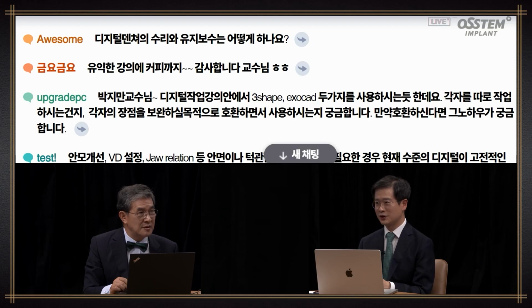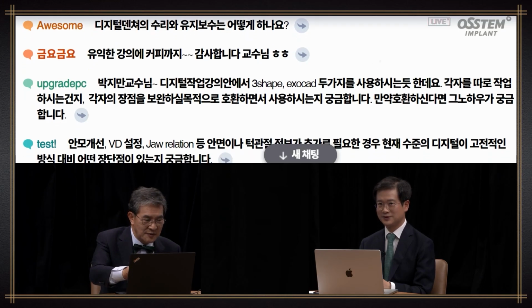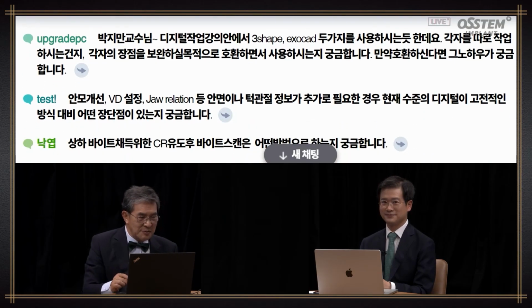Of course, you cannot create exactly the same one digitally, but doing a conventional repair, not a digital repair, would be possible because the material is the same. But when you repair a conventional denture, it becomes weaker, right? So for a digital denture, yes, I would think so too.